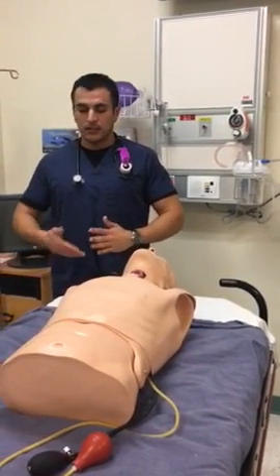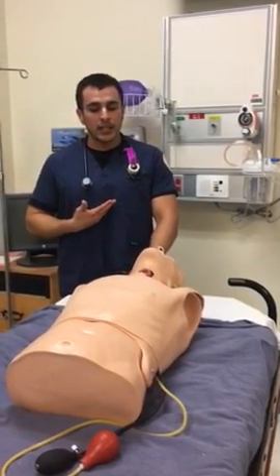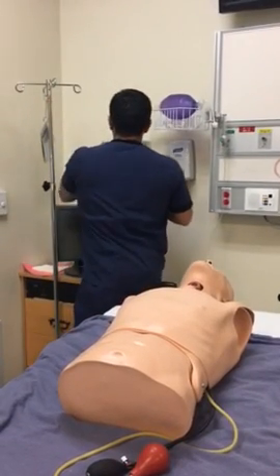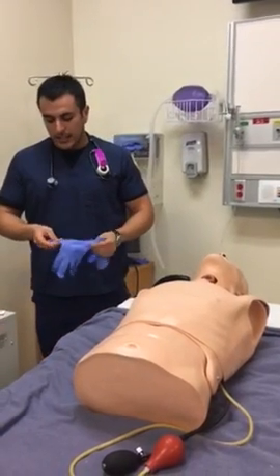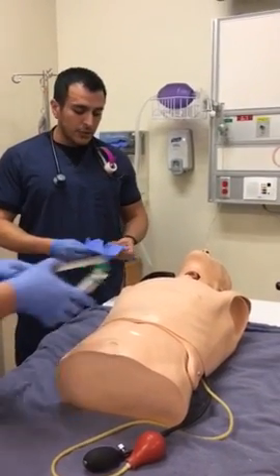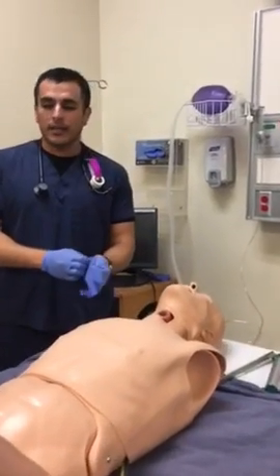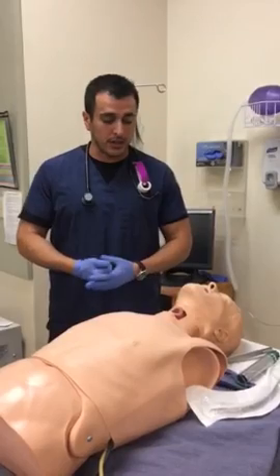Next I would explain. What we're going to be doing today is you're having heart surgery. We're going to be sedating you. When we sedate you, that's going to cut out your drive to breathe. So we're going to be intubating you. What that is, we're going to be placing a tube into your airway, and we're going to be placing you on a mechanical ventilator, and the ventilator is going to be doing the work of breathing for you since you won't be able to do it yourself.